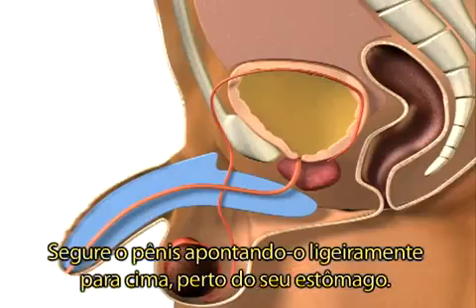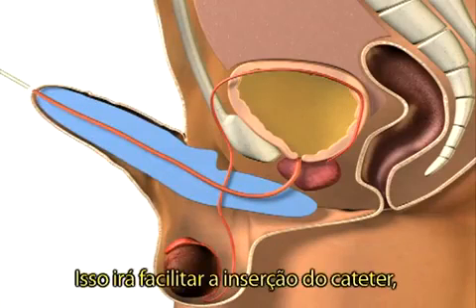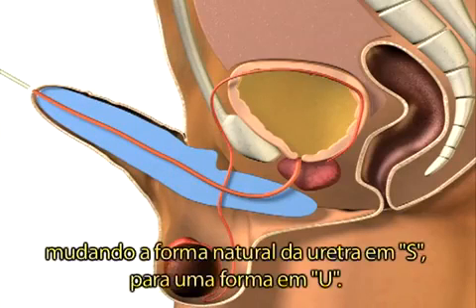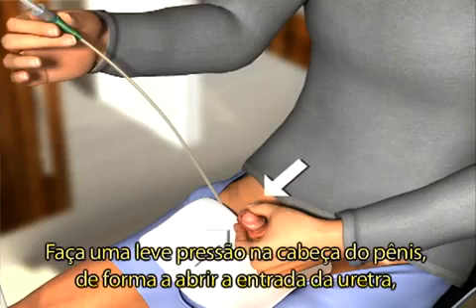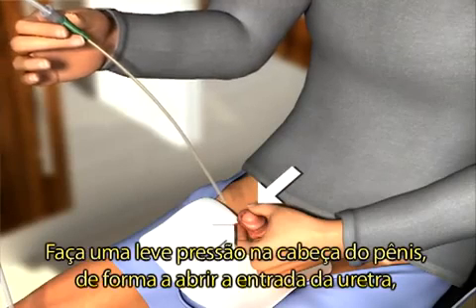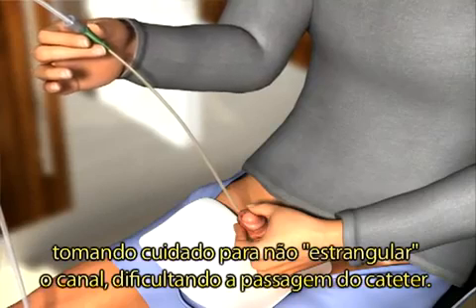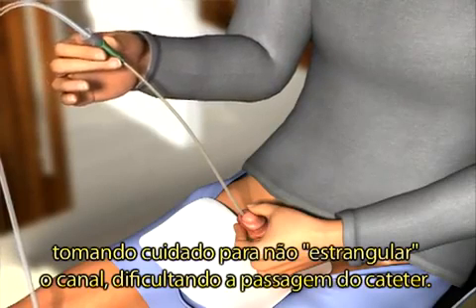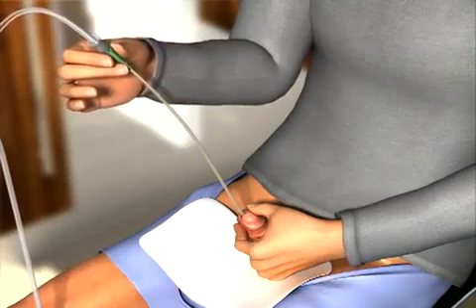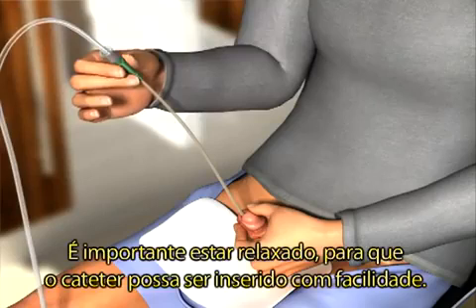Hold your penis pointing upwards and close to your stomach. This will ease the insertion of the catheter as the natural S shape of the urethra is changed into a U shape. Provide a gentle pressure to the head of your penis in order to open up the urethra, but be careful not to squeeze your penis, as this may obstruct the passage of the catheter during insertion into the urethra. To help insertion of the catheter, it is important that you relax.